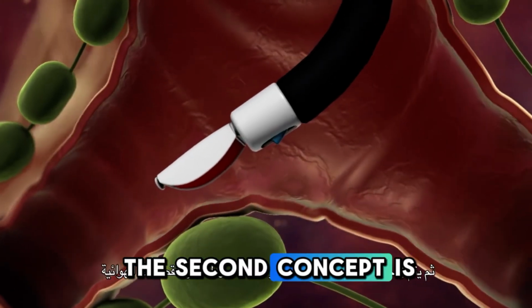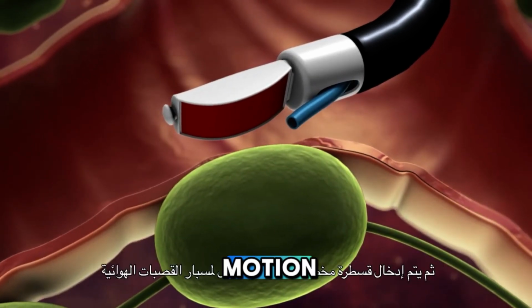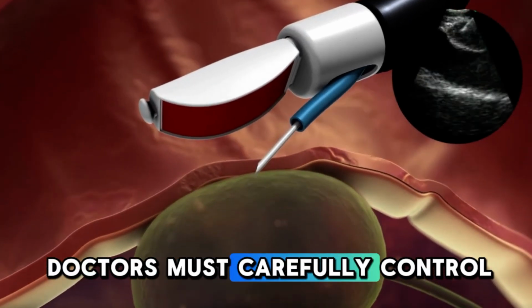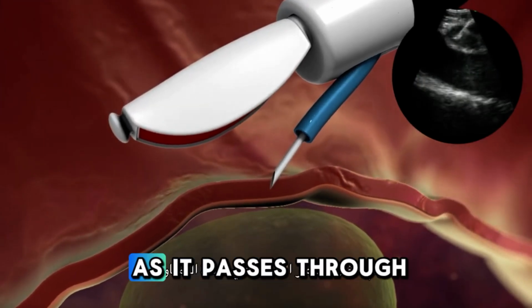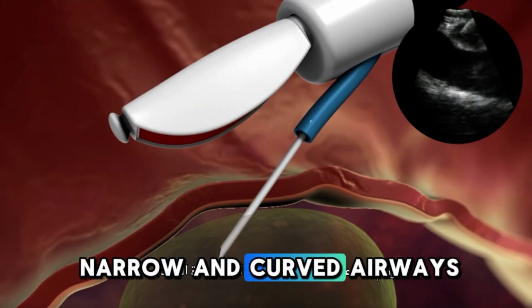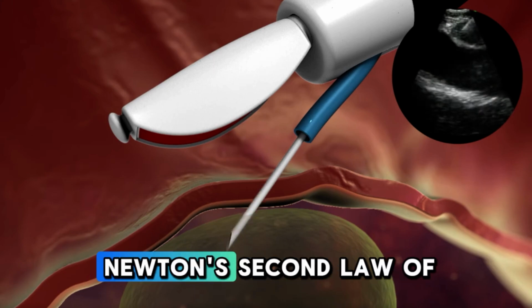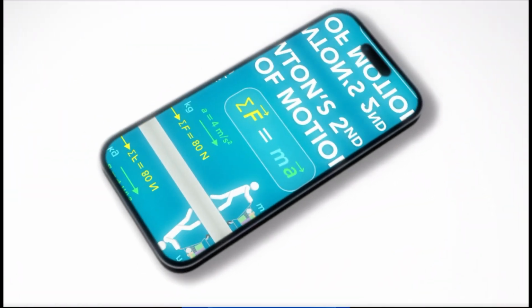The second concept is mechanics, which involves force and motion. During bronchoscopy, doctors must carefully control the movement of the bronchoscope as it passes through narrow and curved airways. This can be explained by Newton's second law of motion. This is the equation.